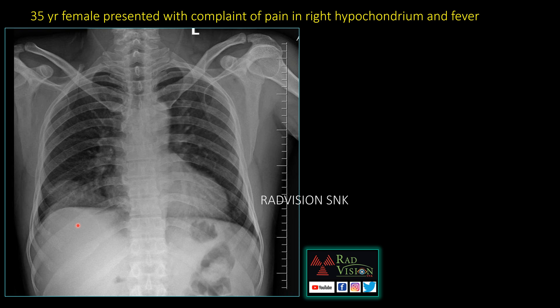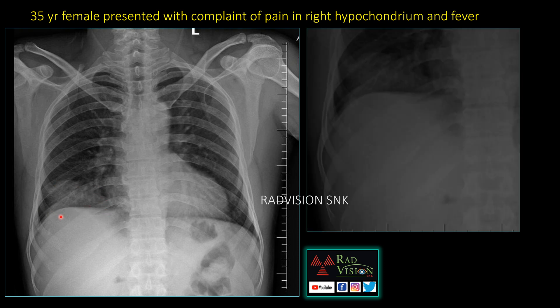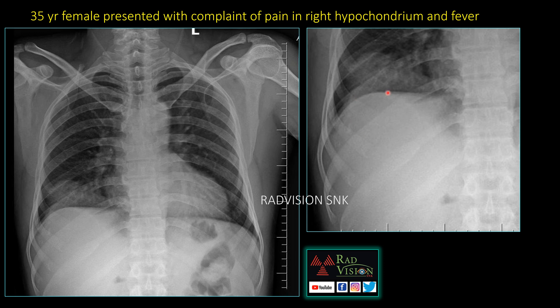This is a 35-year-old female presented with complaints of pain in the right hypochondrium and fever. You can see there is a cystic lesion in the right lobe of the liver with eccentric rim calcification. There is also a radiopaque shadow noted in the right lower lobe of the lung adjacent to the hemidiaphragm on the right side. In the zoomed image, you can see the cystic lesion with faint rim calcification and that radiopaque shadow in the right lower lobe of the lung.